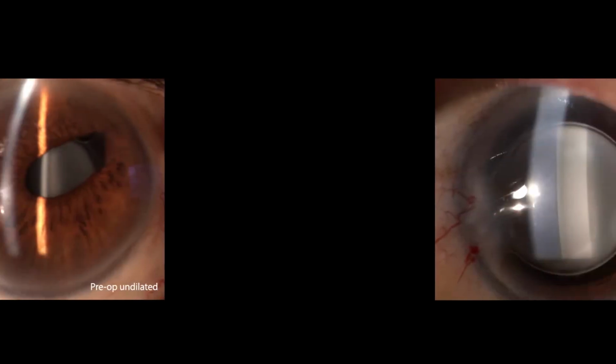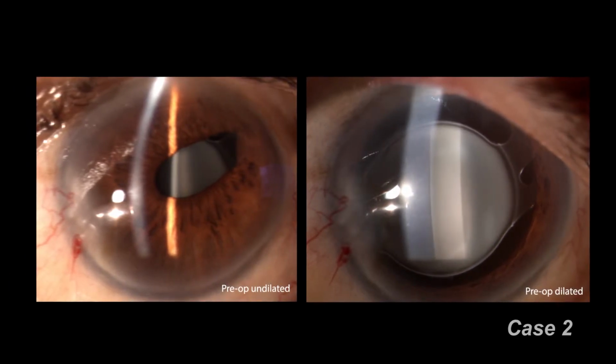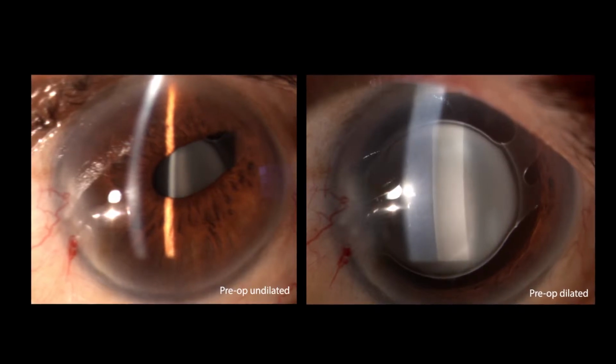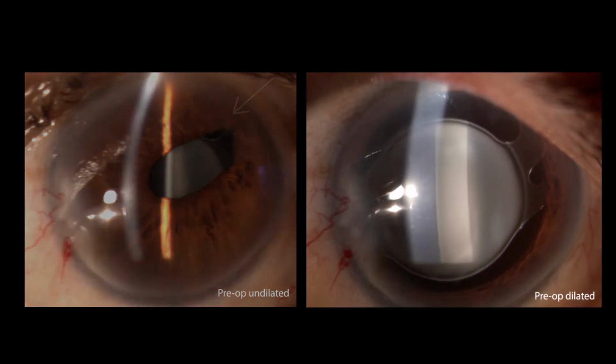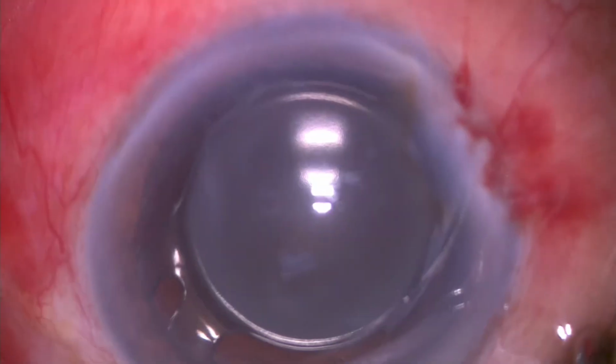Our second patient presented to us with hazy vision. A year ago, he had undergone a phacoemulsification with hydrophilic IOL. On examination, we noted an opaque IOL with a vitreous strand in superotemporal area. An IOL exchange was advised.